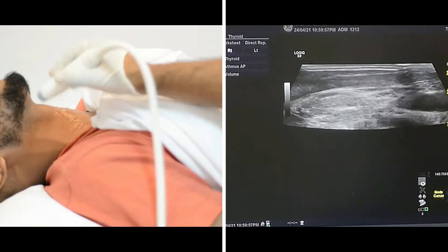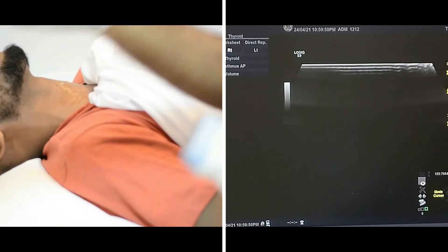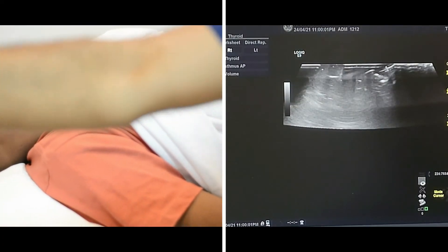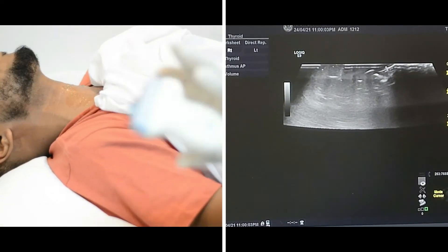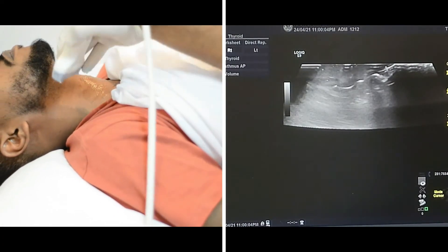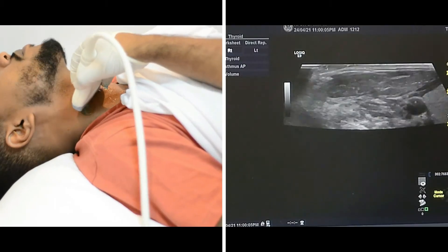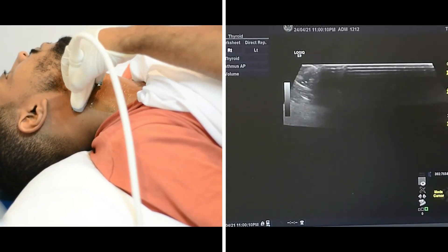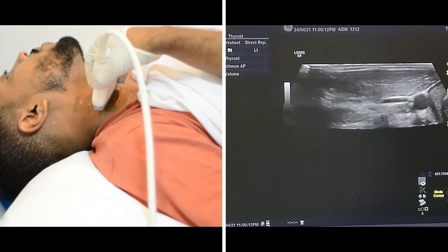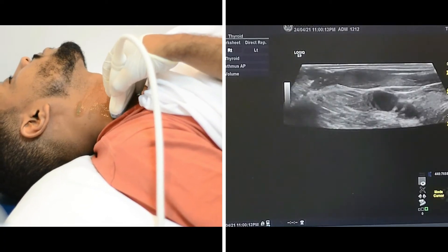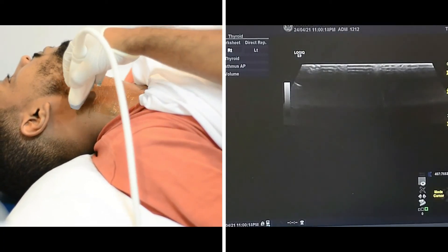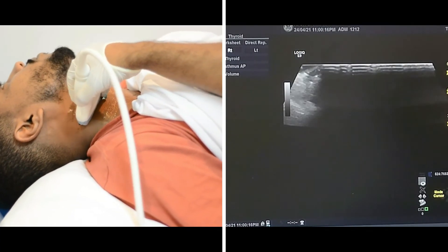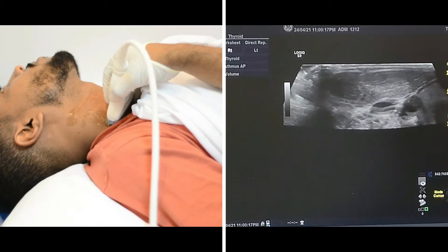Now after I finish with the thyroid, I'm going to check the neck looking for suspicious lymph nodes. I will start by placing the probe in the neck — first the upper neck, then mid neck, then lower neck, which we can also call level 2, level 3, and level 4.